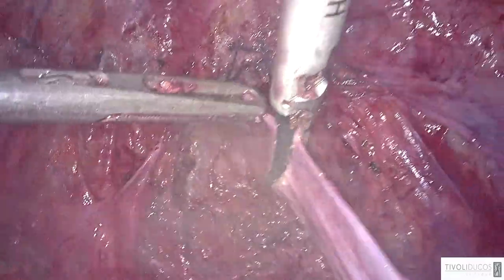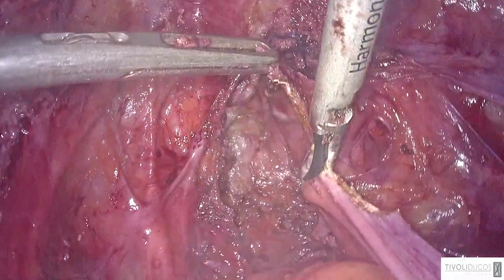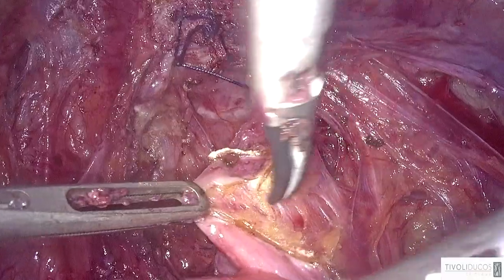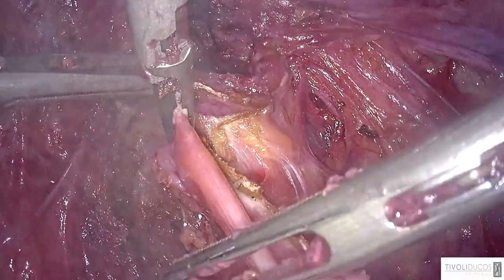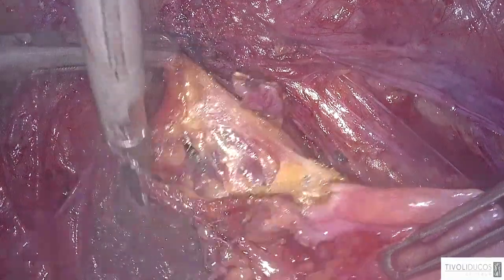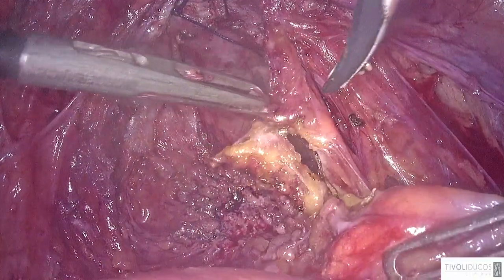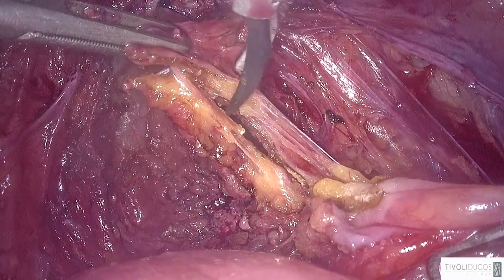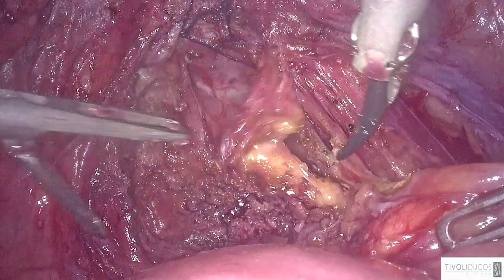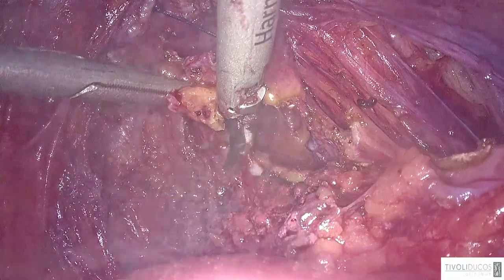So, 3 years ago, I wrote a paper in Seminars in Reproductive Medicine, about nerve sparing, between the optimism of the willing and, I forgot the name of the article, but I discussed that. Of course, we'll try to do a nerve sparing, and we think that it is feasible in most cases, but in some cases, when we have a very large nodule to treat, we have to accept that nerve sparing is not possible, at least on one side.